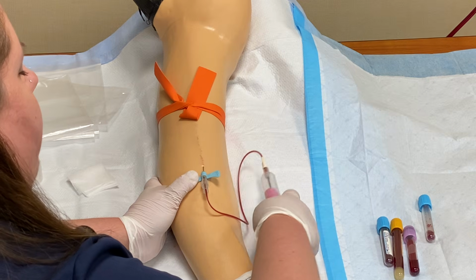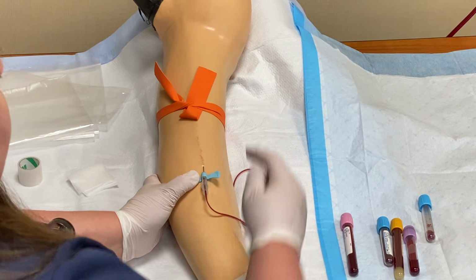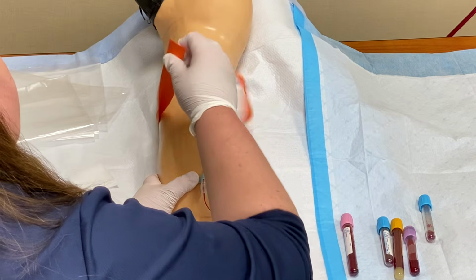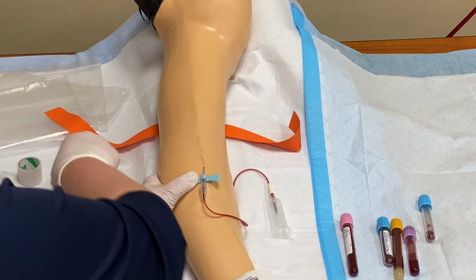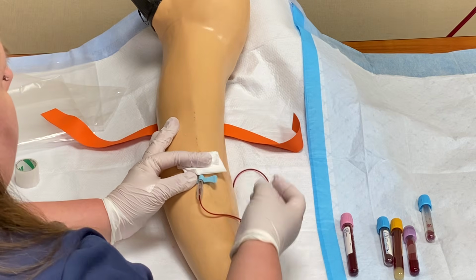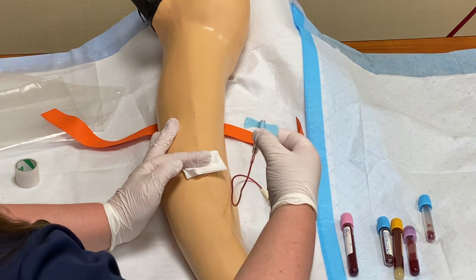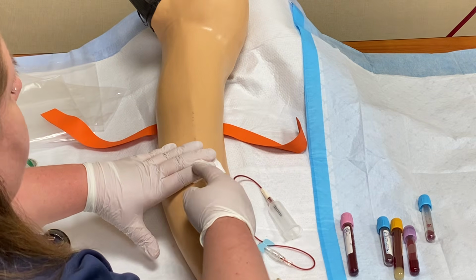All right, once that final tube is full, I'm gonna take it out of the vacutainer holder. I wanna take my tourniquet off next since I have a time limit. I'm gonna grab some gauze and have that ready at the insertion site. Then I want to push the button to retract the needle. Once the needle's out, I hold pressure at the insertion site.